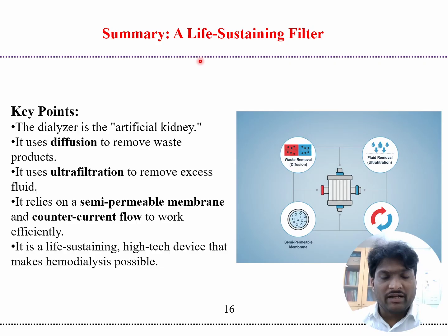And summary, a life sustaining filter. A key point is that the dialyzer is the artificial kidney, and it uses diffusion to remove the waste products. It uses ultrafiltration to remove the excess fluid. It relies on the semi permeable membranes and counter current flow to work efficiently. It is a life sustaining and high tech device that makes hemodialysis possible.